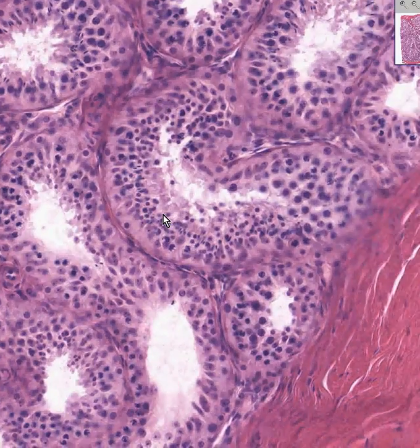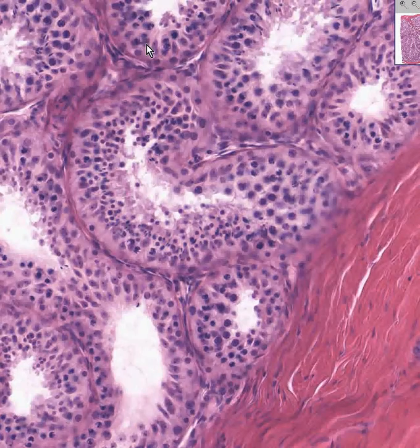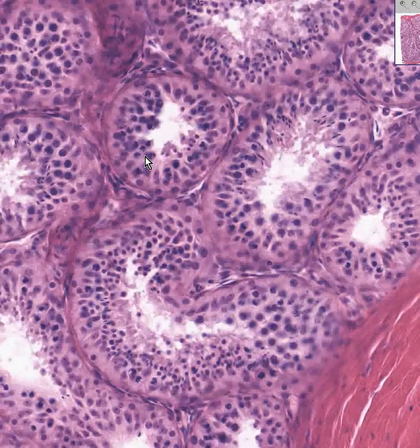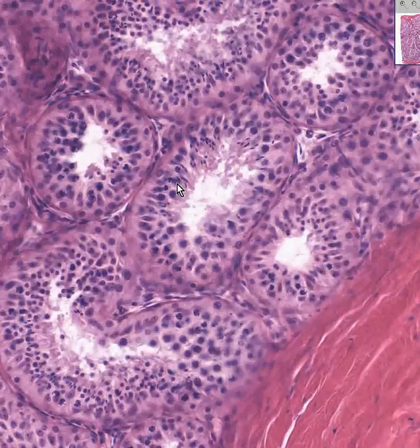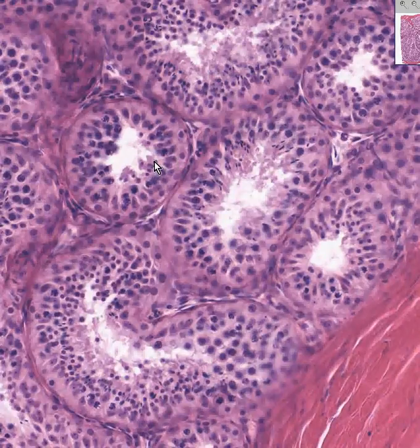There is a cell called a secondary spermatocyte, but it is very rarely seen in human tissues. And when you think you see one, you're probably wrong. So for the most part, let's ignore the secondary spermatocytes. We all know what a mature sperm looks like. It has a very, very tiny slit-like nucleus and a tail, which is usually beyond the resolution of light microscopy. And anything in between, like perhaps here, can be called spermatids.